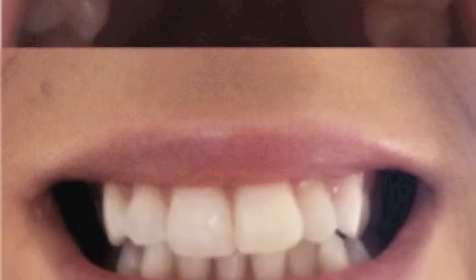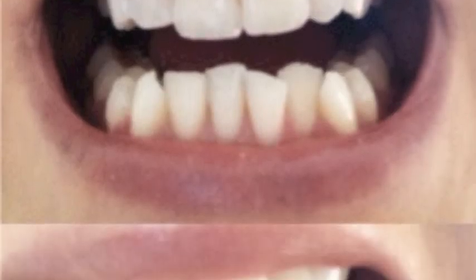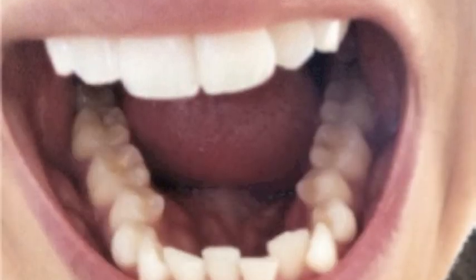They're kind of all over the place really, and I'm not happy with the way that they look. They're tilting inwards and twisting around, which will only get worse with time. So I'm just about to have the 6-month smile, which is like train track braces. It's brackets fitted to each tooth that are clear with retaining wires as well.